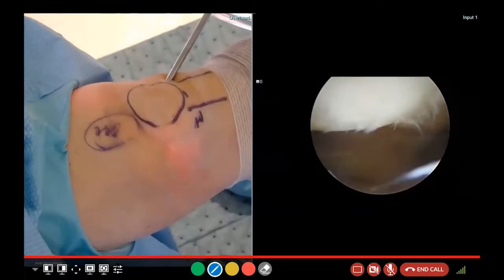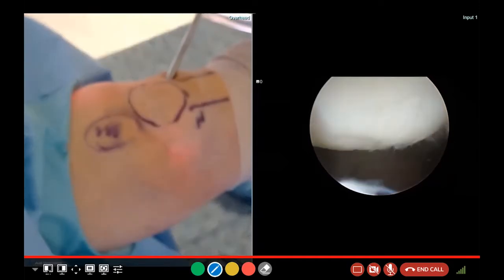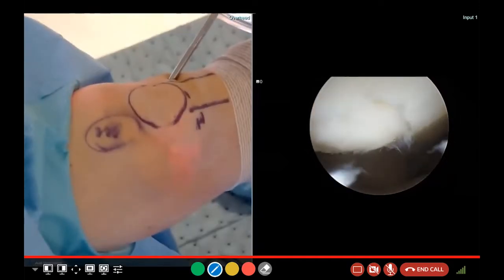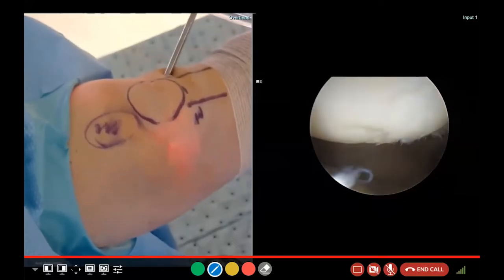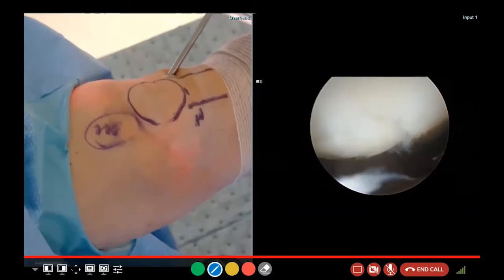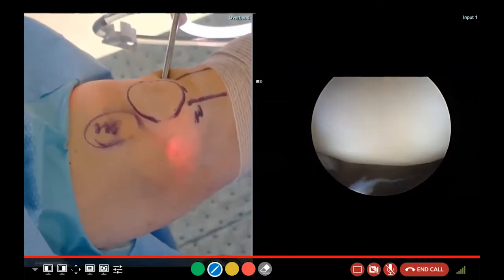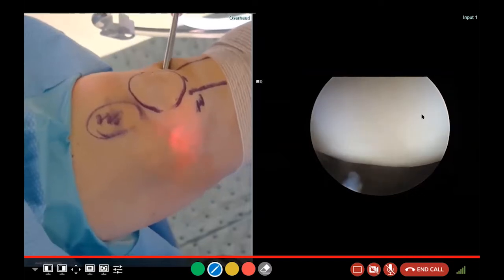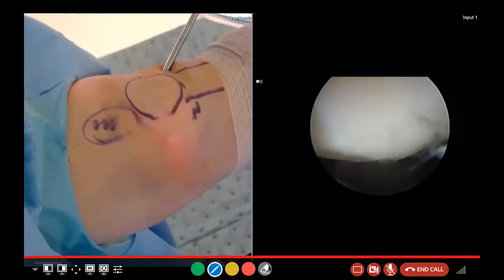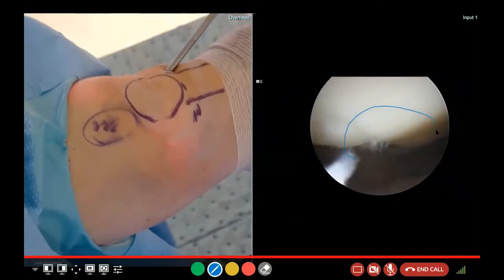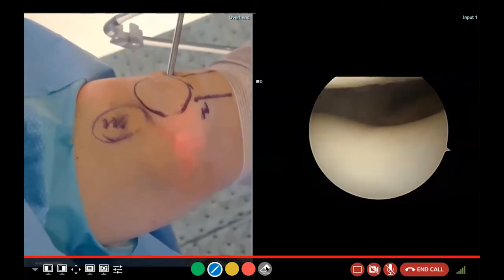Remember, arthritis is the wearing away of normal cartilage. You hear orthopedic surgeons talk about scoping a knee and cleaning out arthritis — but arthritis is the absence of normal cartilage. We can certainly smooth out damage. You can see the damage here in this cartilage, and this is a normal area of cartilage — no evidence of articular damage. That's what it should look like. You can see other areas where it's frayed and torn, much like a worn road.